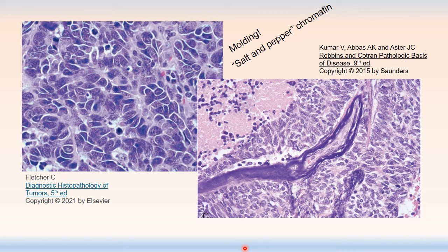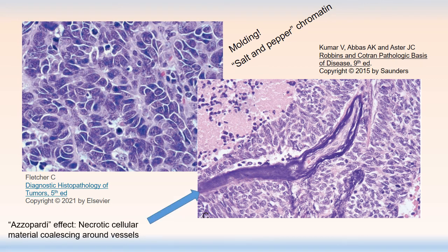You can also look for areas of necrosis — because of the very rapid growth, these tumors will show necrosis, and as the chromatin clumps it can coalesce around vessels. This DNA deposited around the vessels shows a blurred blue-purple haze, and that's called the Azzopardi effect. If you're looking at a tumor that shows this kind of blur of blue around vessels, think about small cell neuroendocrine carcinoma.